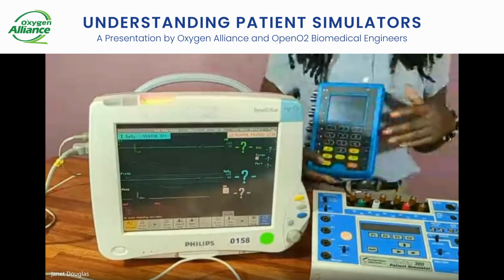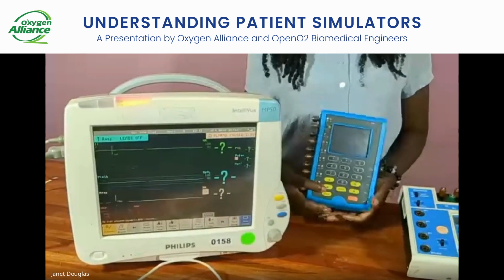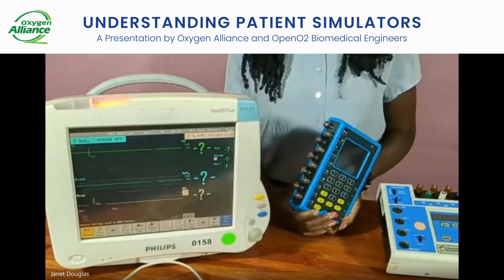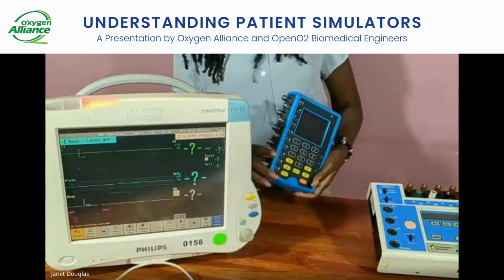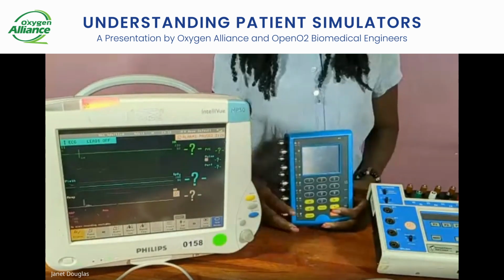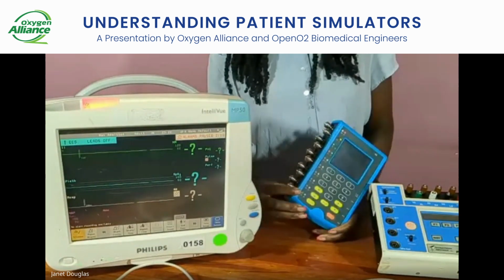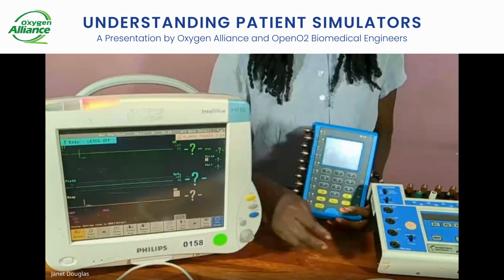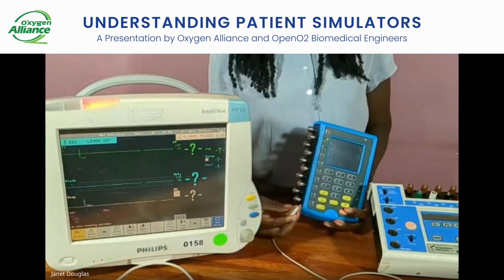Before you turn on your simulator, you have to make sure that you have already connected the leads from the ECG sensor, the ones that are meant for the ECG. Here mostly we use color codes, or we can even use the labelings on your leads or the connections. So I'll start connecting.